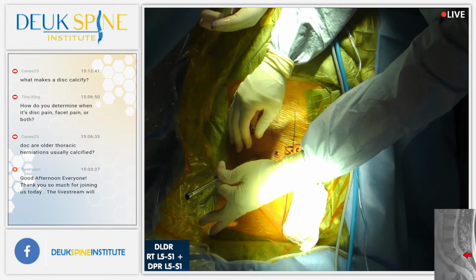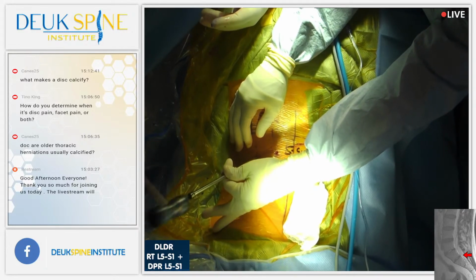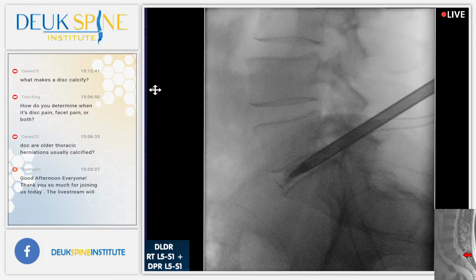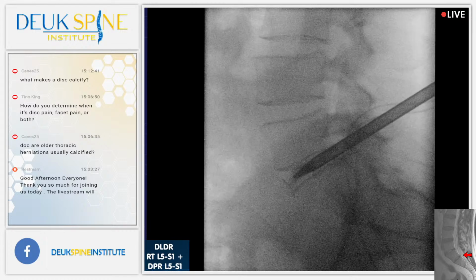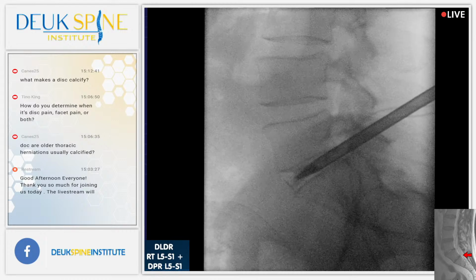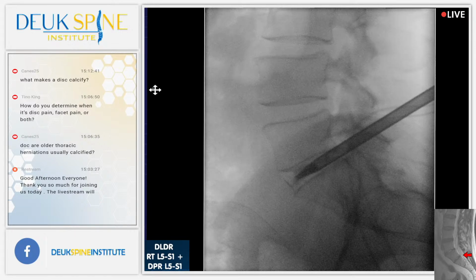If you numb the wrong one, then it's not going to take the pain away. Sorry, Luis. Oh my gosh, Luis is going to kill me. I'm sorry. I could blame you and say you moved, but unfortunately it's all on film, and you could see that you did not move. So it's all my fault.